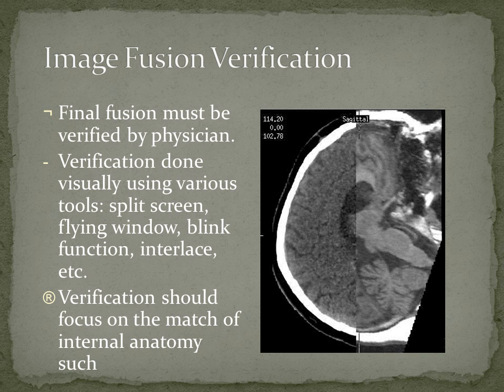In the image fusion, it's important to actually check very carefully that the fusion works. There are two things that can happen with an MR scan. One is that you will always have an MR scan that needs to be rigidly adjusted, meaning the MR scan itself has structural integrity, but the scan needs to be adjusted so that it lays over the CT scan.